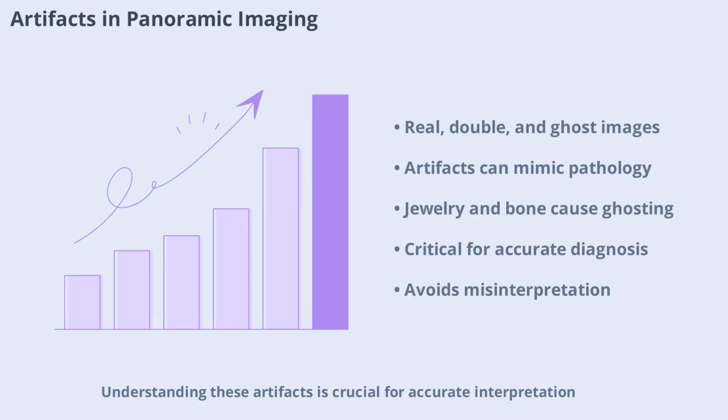Understanding these artifacts is crucial for accurate interpretation, as they can mimic or obscure pathology. Common causes include jewelry, the hyoid bone, or the cervical spine. Clinicians must distinguish these artifacts from genuine findings to avoid misdiagnosis and ensure effective treatment planning.